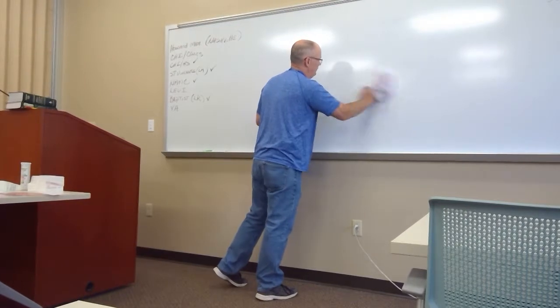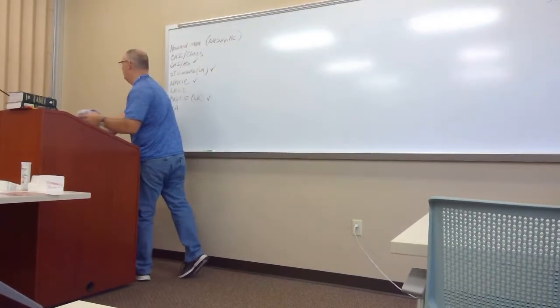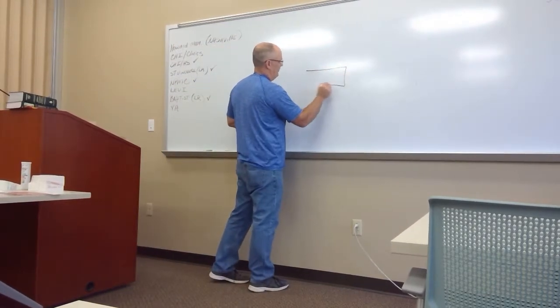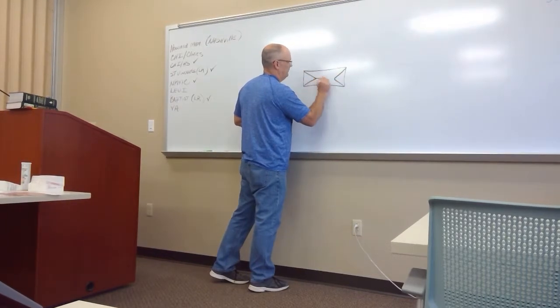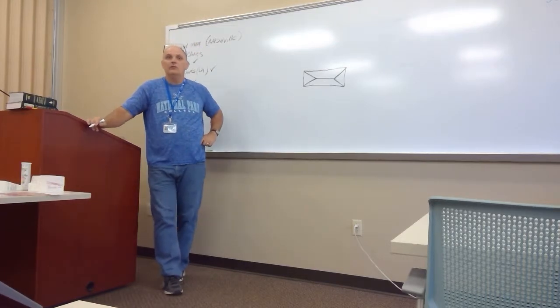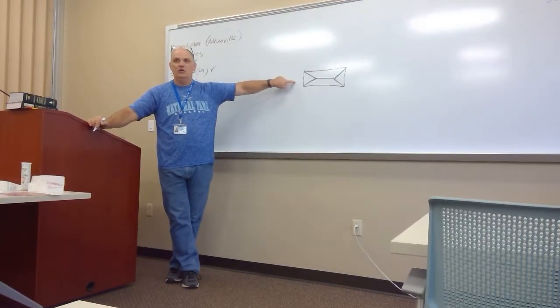I'm going to draw a picture on the board of the most common alkaline crystal you will ever see in a urine specimen. It's called triple phosphate, and they are shaped like this. They call it a coffin lid appearance. Everybody with me? A coffin lid appearance, triple phosphate.